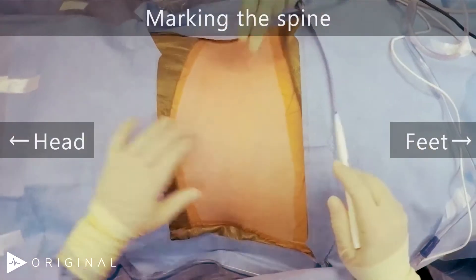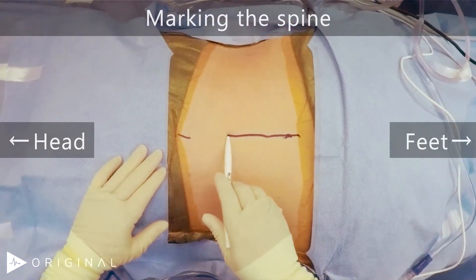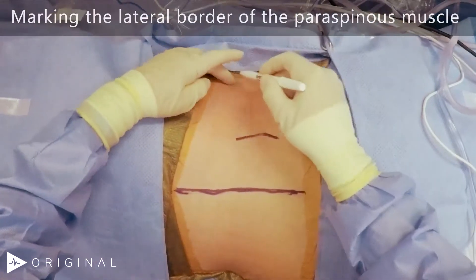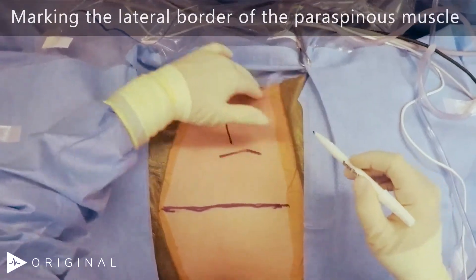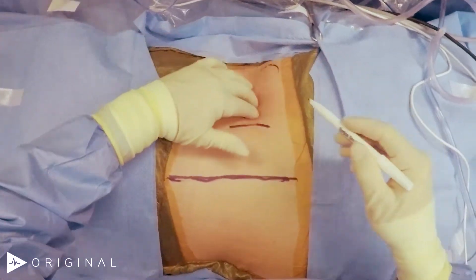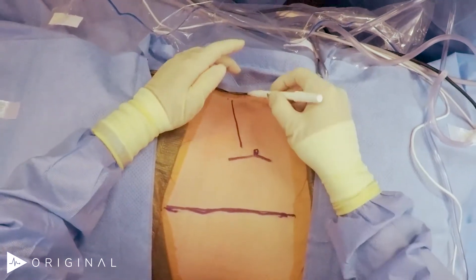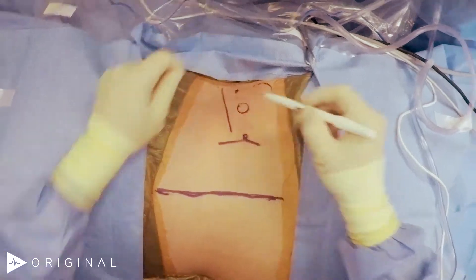So you want a 5-0 or 10-0? 10-0 for the entrance. Rib, anterior iliac crest. So generally a 5 here, probably a 5 here, and then the bigger here. No room for 4. I wish we could. We're doing a 10.